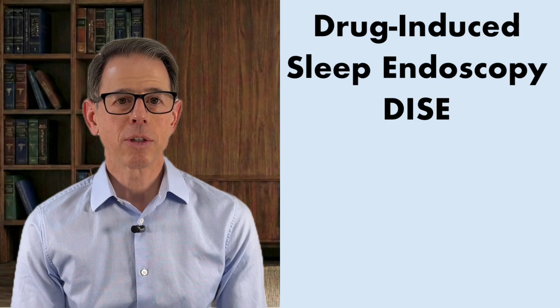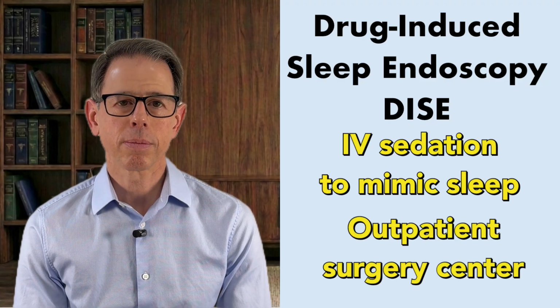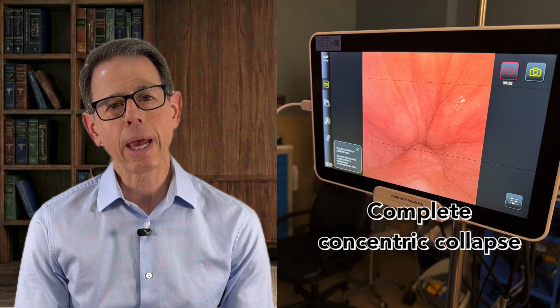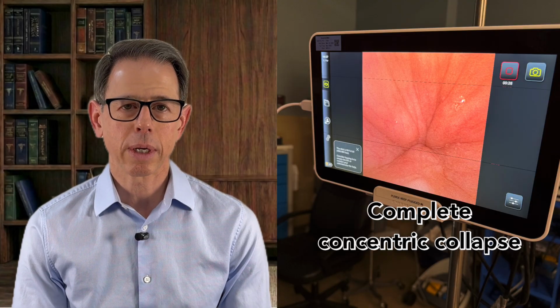Next, we schedule a drug-induced sleep endoscopy, also known as DISE. This is performed with IV sedation in an outpatient surgery center. While you are asleep, the endoscopy is repeated. I watch the inside of your throat to see apneas as they happen. During the apneas, I can then see exactly where in the throat the collapse is occurring and in which direction. Sometimes there is collapse in more than one location.